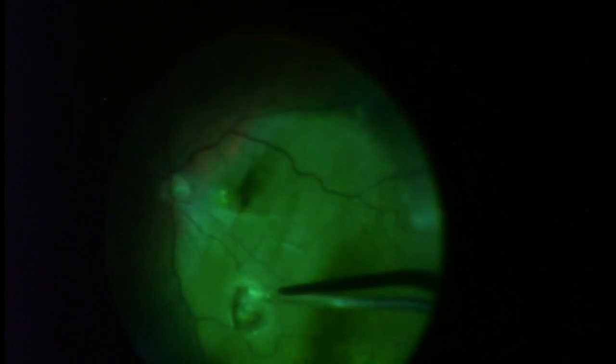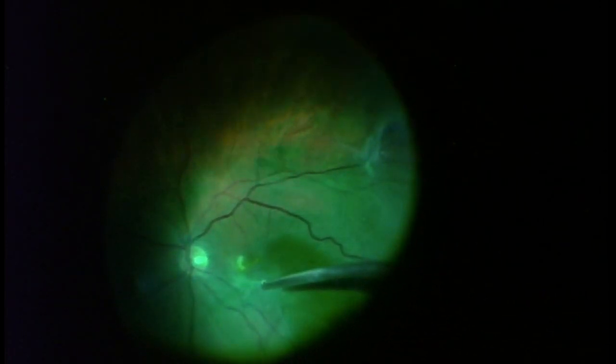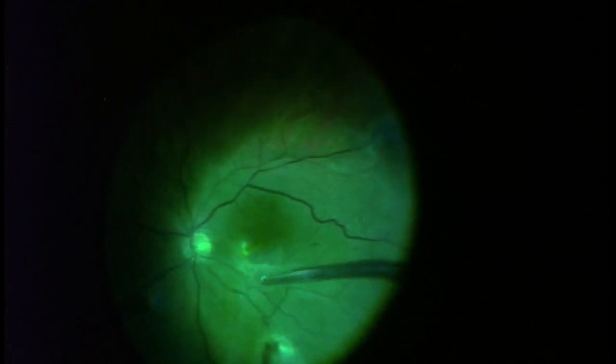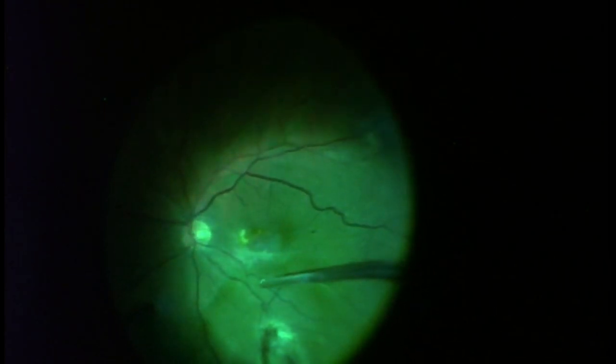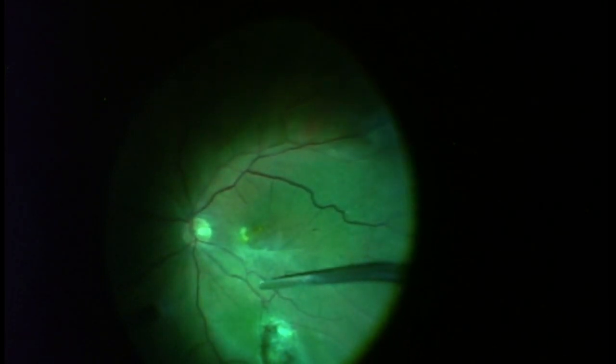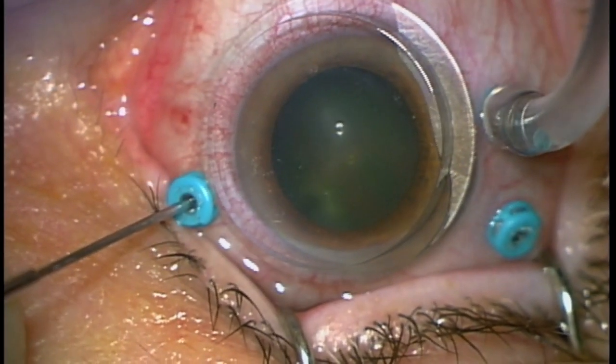That metal rod that you see, the vitrector, is actually removing fluid. So the tube acts as a conduit to keep the eye filled with balanced salt solution, which is just a fancy term for artificial saline. The goal at this time is to remove the excess dye. Once I've done that, I'm going to put on a magnifying glass, which I just did there, and put the forceps in through the right sclerotomy.